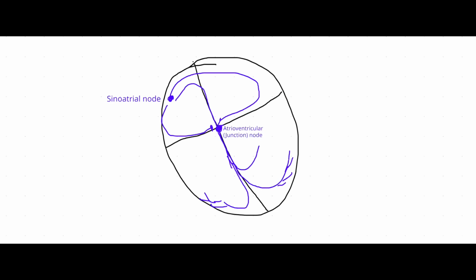And then you have your bundle branch. So you have the right bundle branch on this side. And then you have the left bundle branch on the other side. Okay, and then the Purkinjes. Okay. Now, when we're looking at the EKG, we have either 3 leads or we have the 12 lead, right? We have the 5 lead or the 4 lead, but really it's just the 3 main leads that we're looking at, okay?